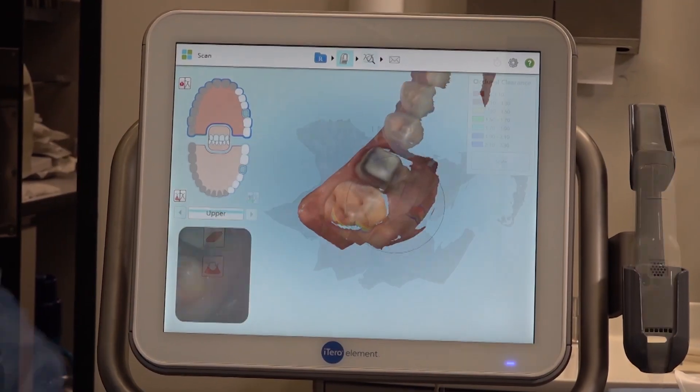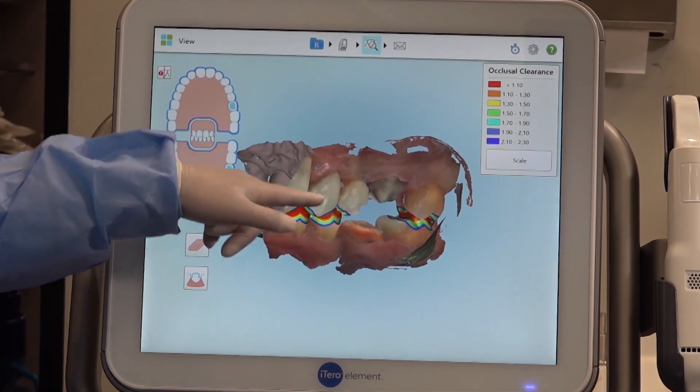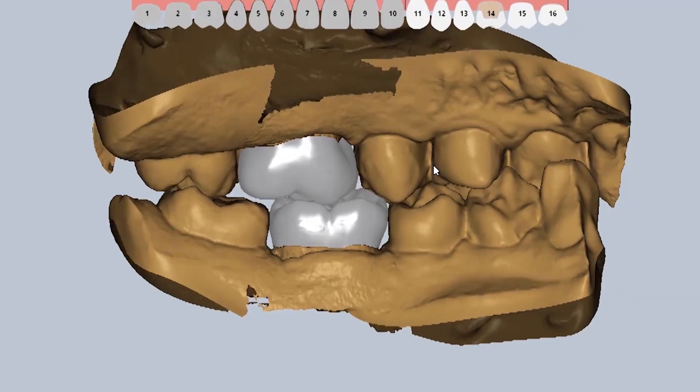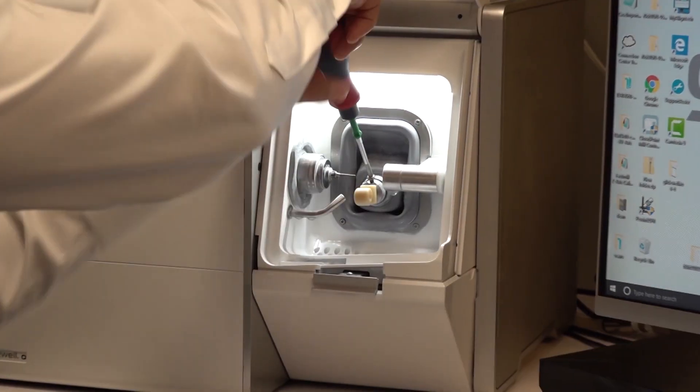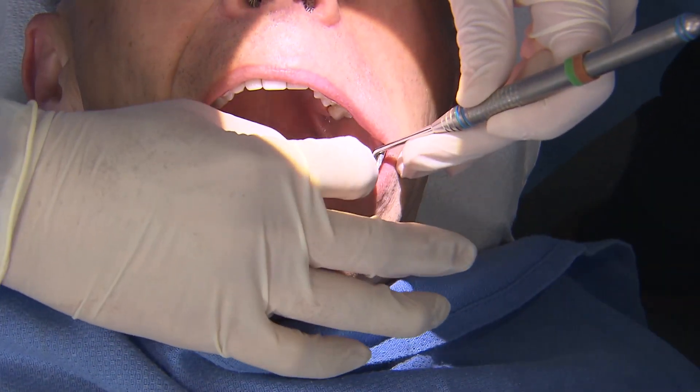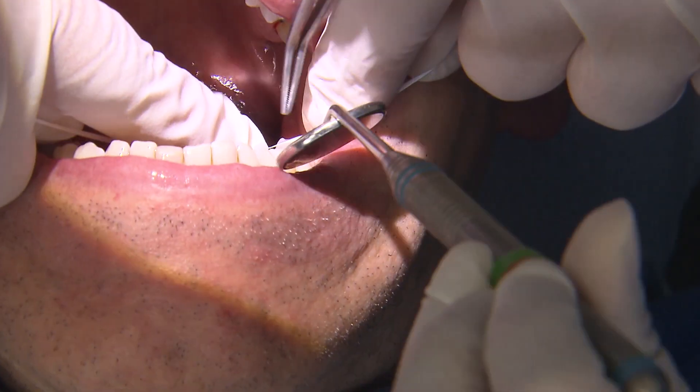The digital impression is then transferred to the Fast Design software, where we're able to custom design both opposing restorations at the same time. After 5 minutes, when the design is complete, I'll load a Bruxer Now block and diamond bur into the Fast Mill. We now have the lower crown finished and ready to try in once the sprue is removed.